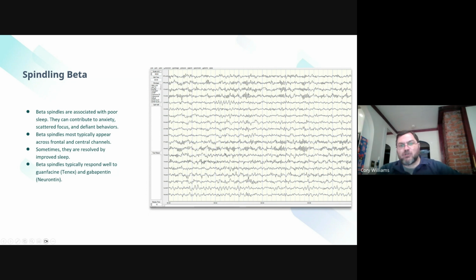Now, usually you see these frontally. Sometimes you see them in central channels as well.